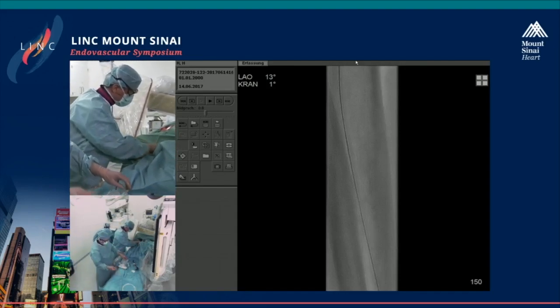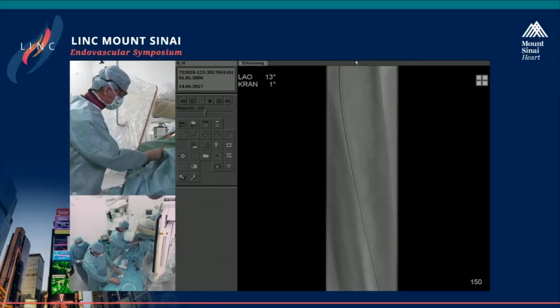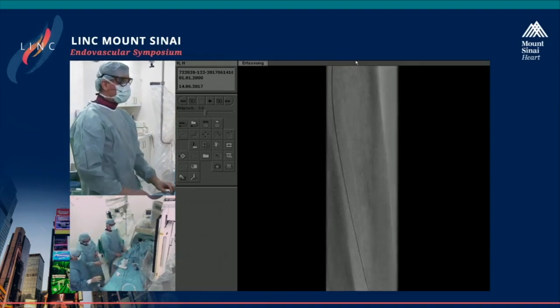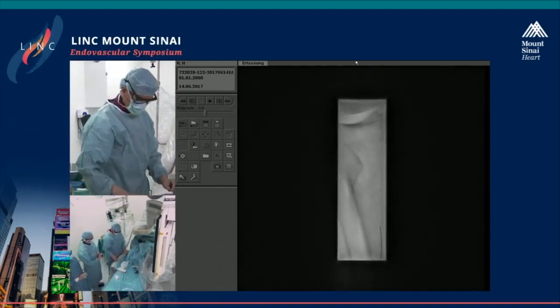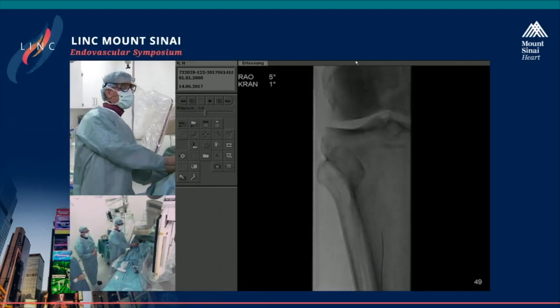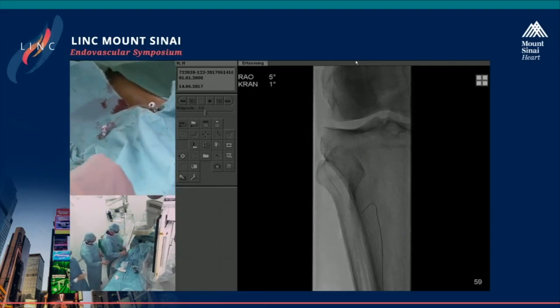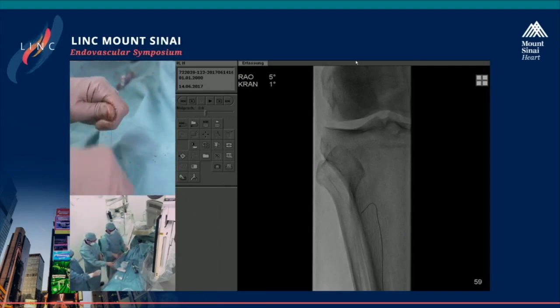Yeah, the advantages of micro sheaths are relatively clear. You can really nicely change from support catheter to balloon and vice versa very easily. And really, in difficult lesions, that is a clear advantage when you want to do something like double balloon technique within the occlusion, if you need this here, for example. So therefore, in more complex lesions, clearly, I start directly with a sheath. In other lesions, you may also start with a support catheter only.